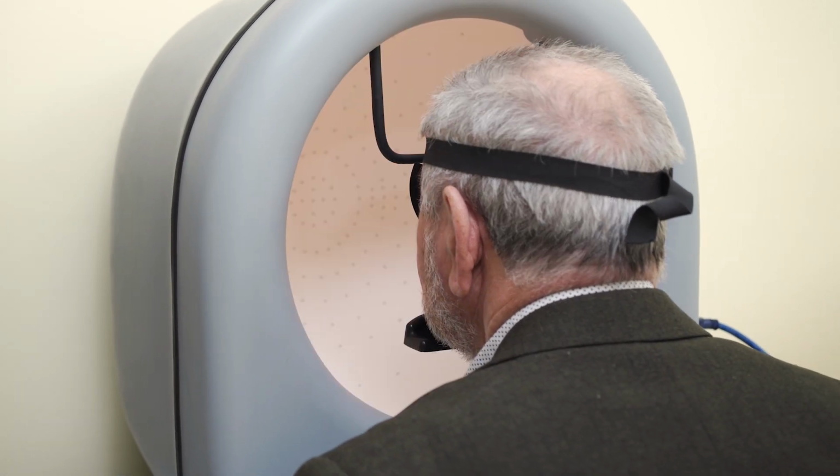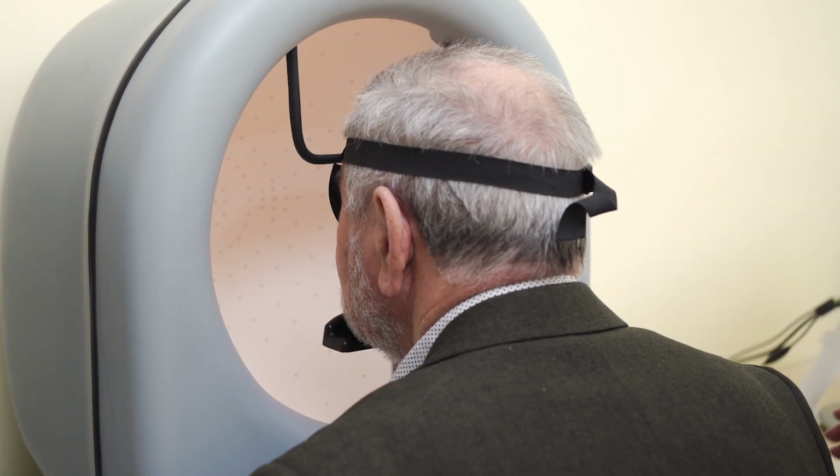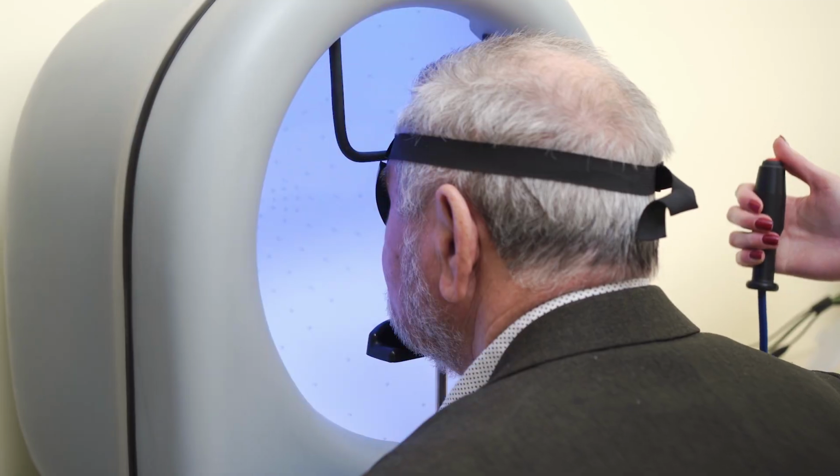We're asking the patient to fixate at a point straight ahead, and as they're fixating at that point with one eye, we're measuring lights of different intensities at multiple points in their visual field. We are trying to detect if there's any areas of decreased sensitivity in their visual field. They may not necessarily have a blind spot, they may still be able to see in that spot, but they may have less sensitivity, and that in and of itself is part of glaucoma, and that can be early glaucoma. So people will develop less sensitivity in one point of their visual field before it becomes a blind spot.